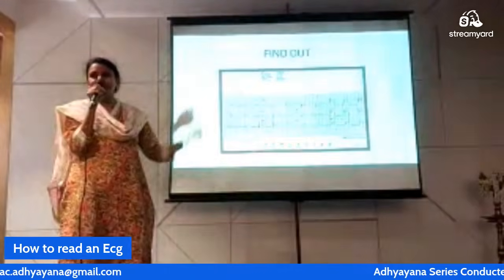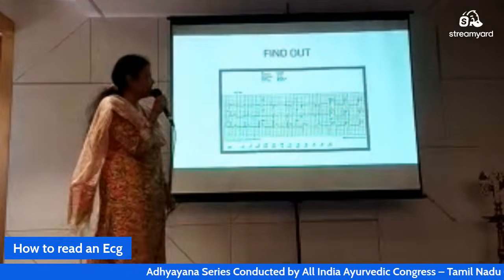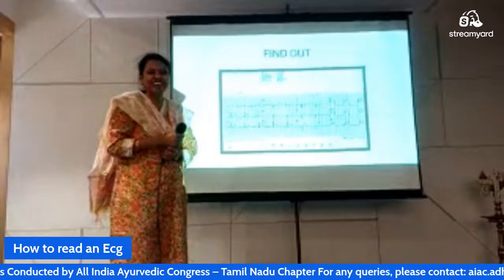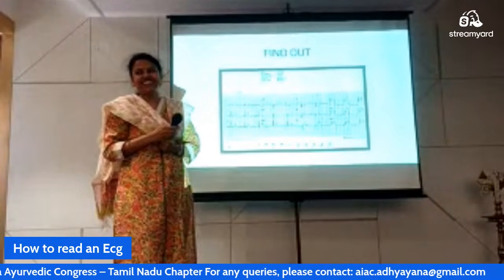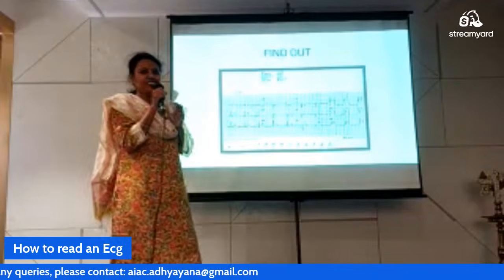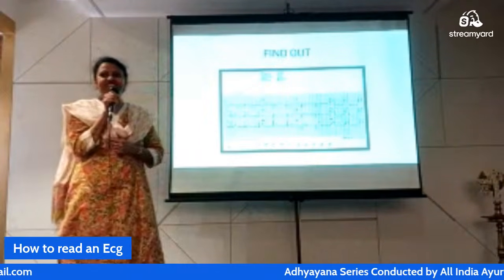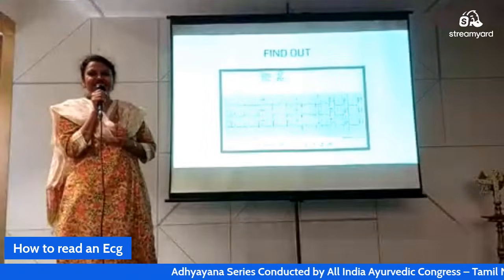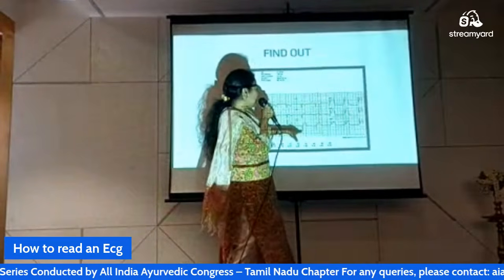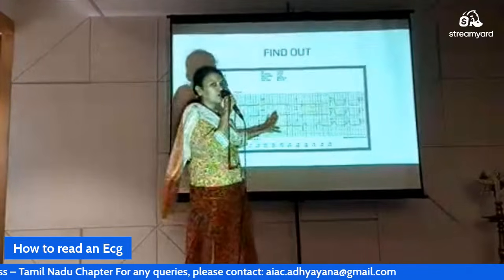Now it's time for you. Just tell me, what is this ECG? It's time for you. I'll just give you a key. It's an MI ECG. No, MI ECG. I think Sheikh is trying. Yes, very good. ST elevation in V4, V5, V3 also mild. So it's an anterior myocardial infarction. Good. Okay.